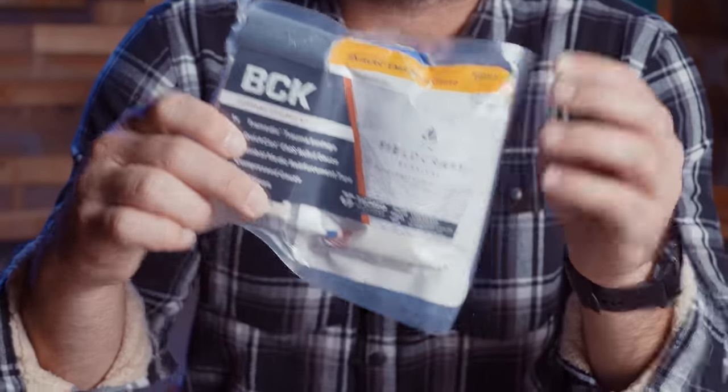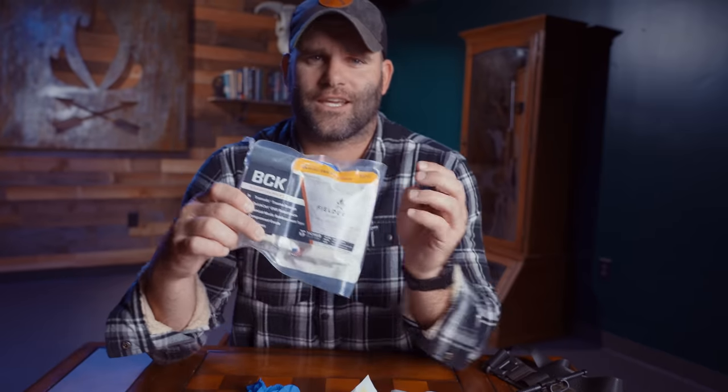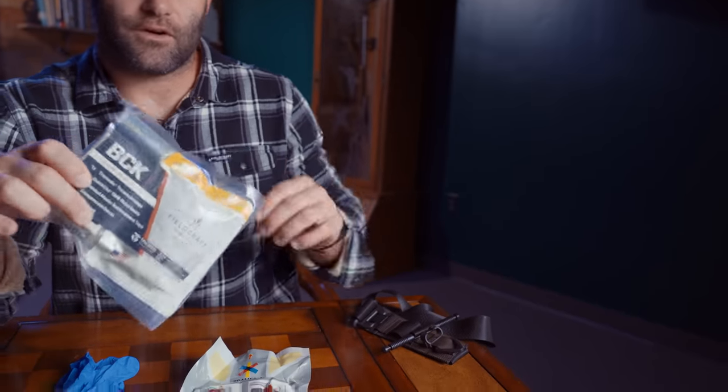We've come up with this bleeding control kit, and this in conjunction with a tourniquet of whatever preference you might have — CAT, SOFT-T, or any of the others — I'm just kidding. This bleeding control kit, again in conjunction with a tourniquet, is everything we're gonna want to manage massive hemorrhaging for at least one person. What I want to do real quick is talk about what's inside the kit and how it's used.